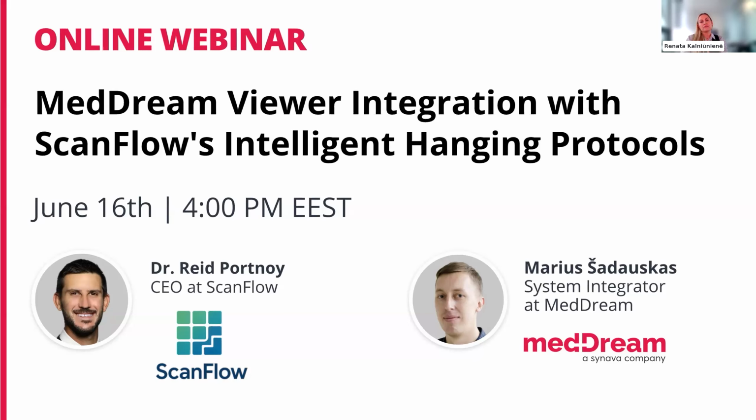Today we have a dedicated webinar on MedDream Universal DICOM Viewer integration with ScanFlow's intelligent hanging protocols. Soon you will see our guest speaker's presentation and, of course, the most interesting part, the live demonstration.